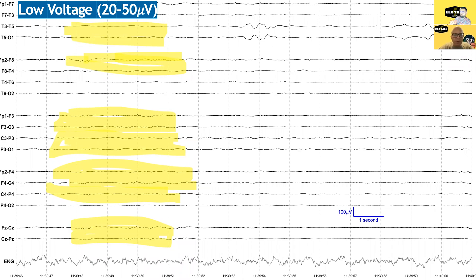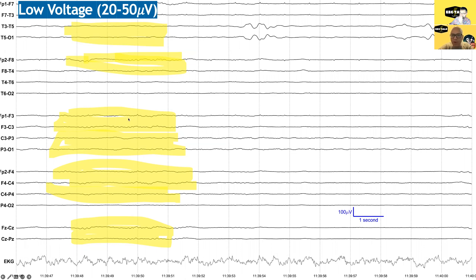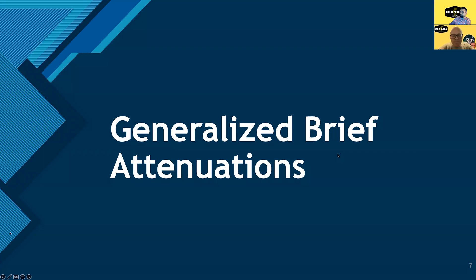Here's an example where the voltage is low. Looking at the scale bar showing what 100 microvolts looks like, you can eyeball that this is somewhere between 20 and 50 microvolts. Getting more exciting — there are intermittent generalized attenuations.